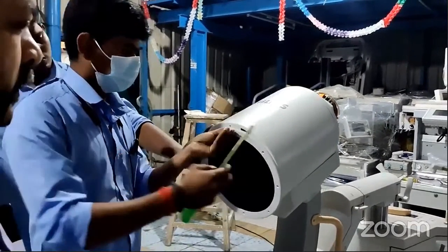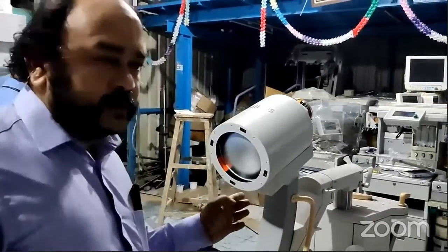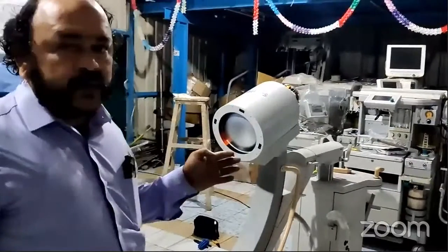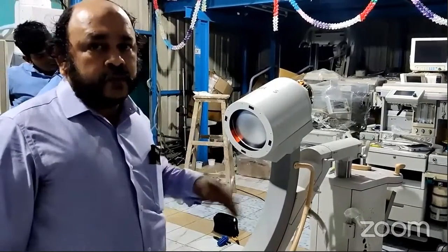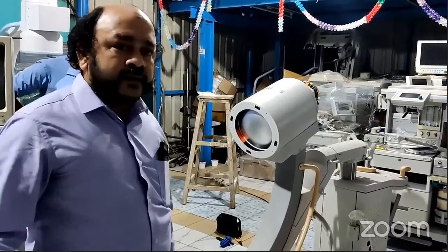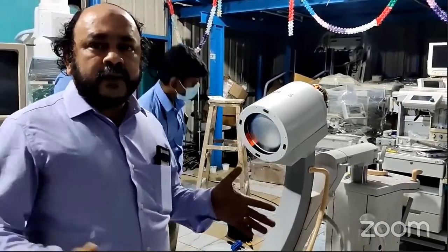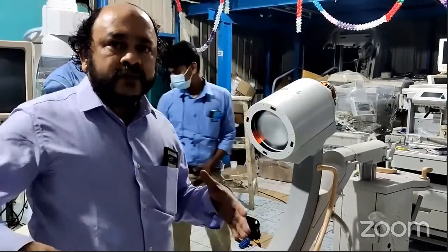These are our radiography, radio imaging systems, and the license will be provided by the AERB. AERB means Atomic Energy Regulatory Board. So they have to issue us a license. Okay, because they have some norms, for example if we are going to keep this C-arm inside the theater, or you are going to keep the X-ray in a different place. So they have some norms for safety and security.